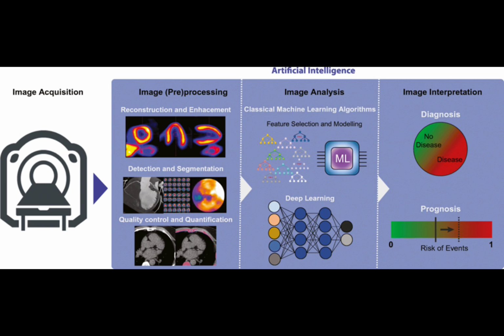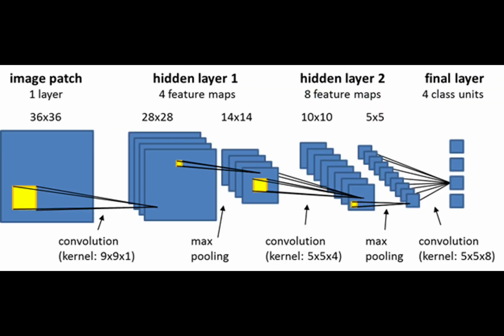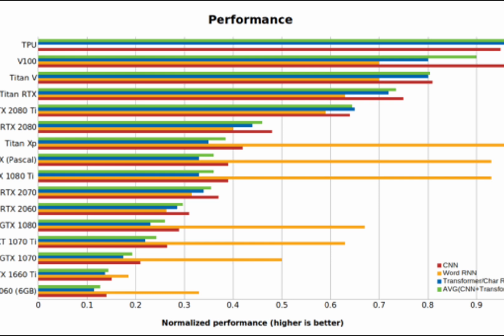Convolutional neural networks excel in image analysis, but there are better choices for object detection and images with a low amount of pixels. The model's numerous layers require a significant amount of time to thoroughly learn and adapt to all the tasks that we're asking it to do. And for using the full potential of CNNs, we need a computer with a powerful GPU to make sure the model operates efficiently and effectively.